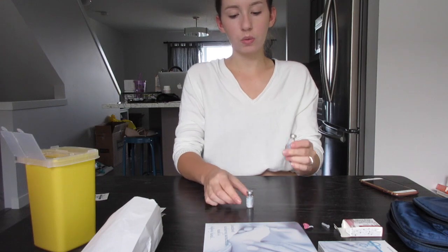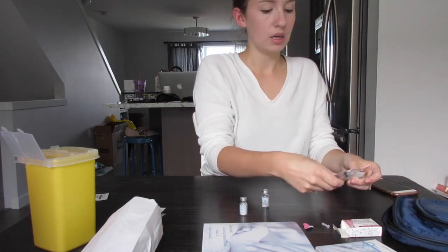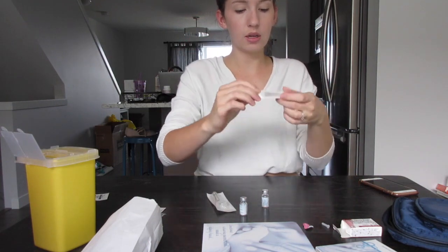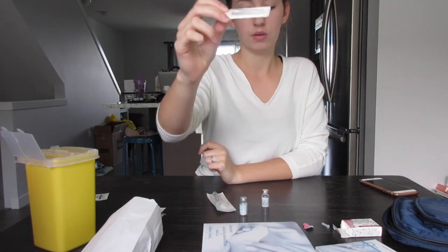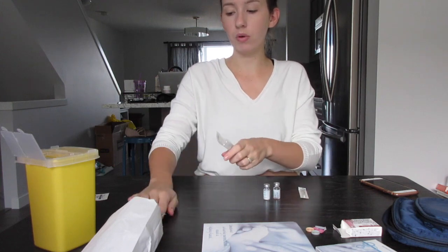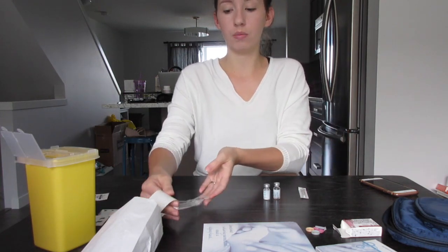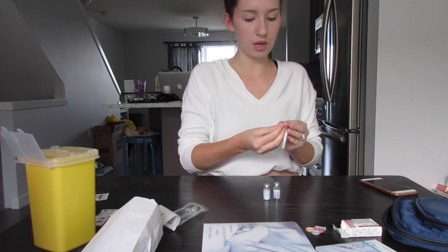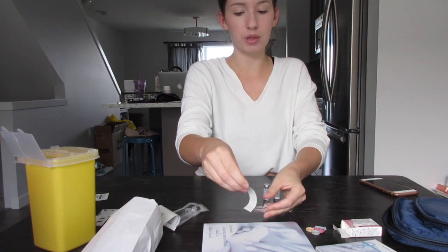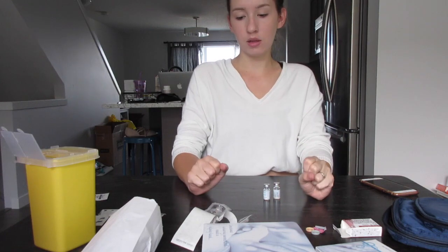Okay, so you're going to use the liquid first, but what you'll need is a syringe and the needle that goes with it. All right, so what I like to do is have everything prepped and ready on the table for me, so that I'm not fiddling with anything and trying to rush it. So I'll just open the packages, leave them in the package but placed open so that they don't get contaminated with anything. Then they are ready to go.